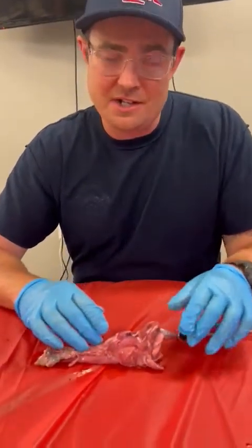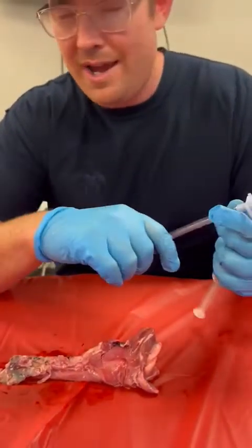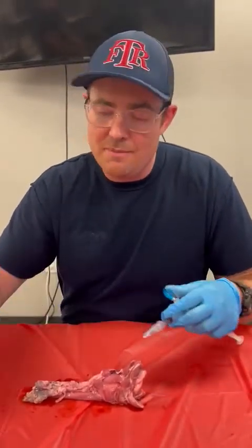Some materials that you're going to need: you're going to need a scalpel, a 6-0 tube or some sort of cric kit that comes with the tube, a 10 ml syringe, and something to hold this thing down — either tape or a commercial device, that would be preferred. But I don't have either of those, so we'll make do.